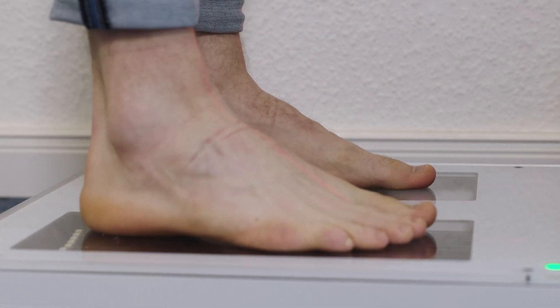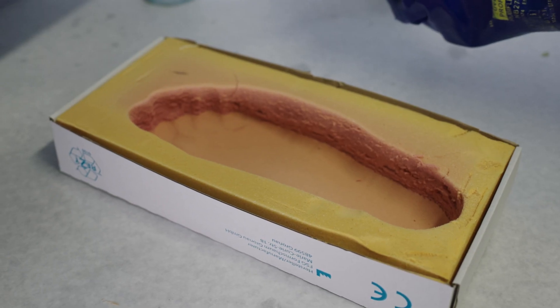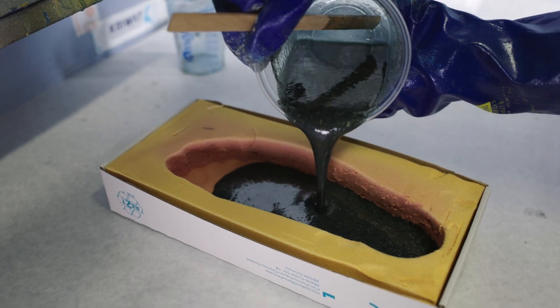Digitization also provides us with many logistical advantages. We have 3D scanners in our stores in Hamburg, where the new digital workflow makes it much, much easier to send data back and forth. It wasn't always like that at all. We'd have to transport goods, which was a lot more hassle, and we needed to make several trips.